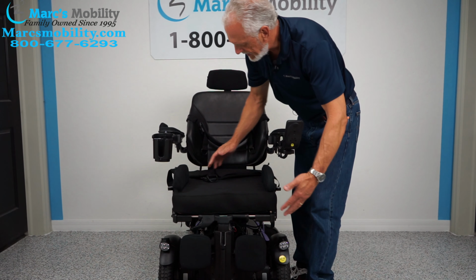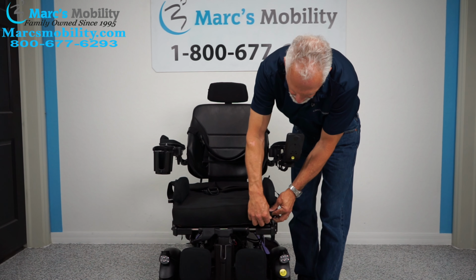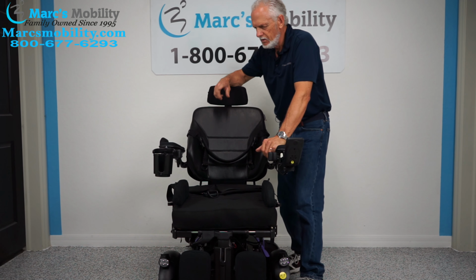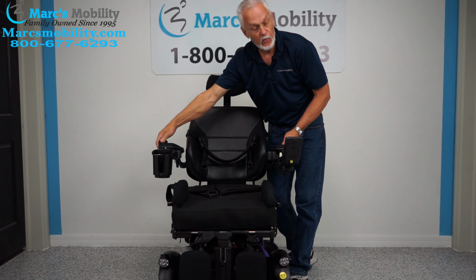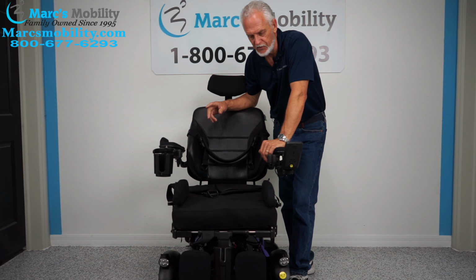The seat is 20 by 20. This is a Roho cushion. It's an air cushion. We can pump air in here through this valve right here with a little plastic pump. Now, one thing. Right now, this chair, from here to here, is pretty wide. It's about 28, 29 inches. So this was set up for a large person.